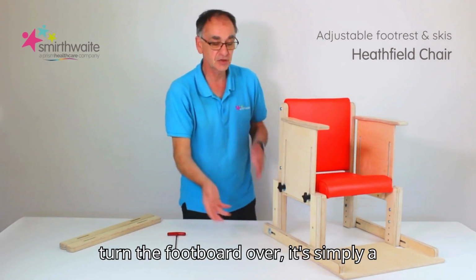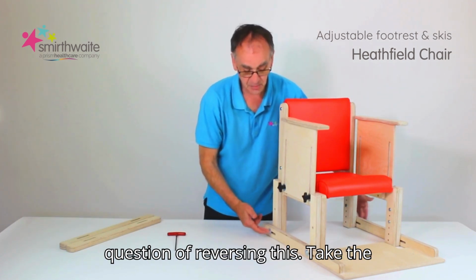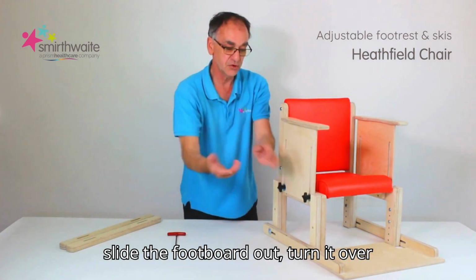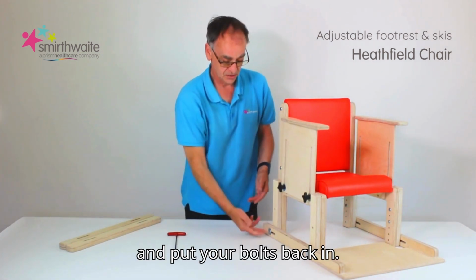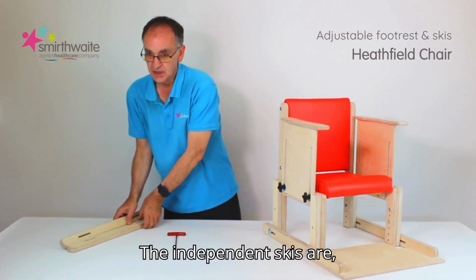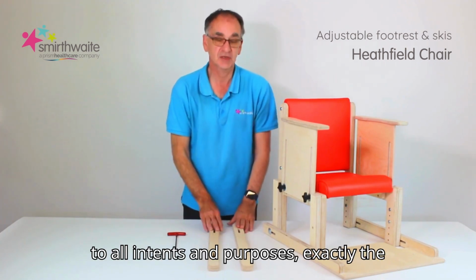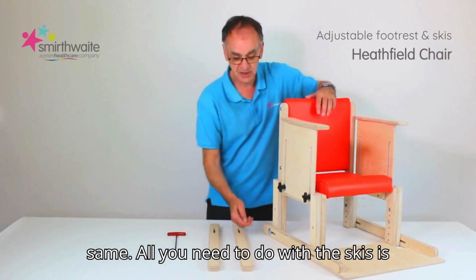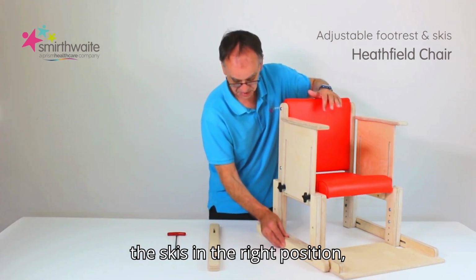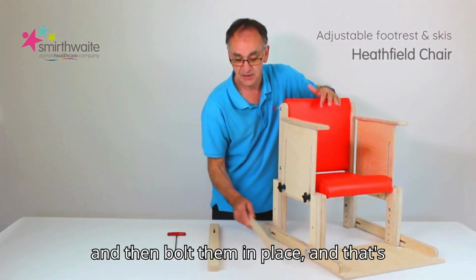If you do need to turn the footboard over, it's simply a question of reversing this. Take the bolts out here and here on both sides, slide the footboard out, turn it over and put your bolts back in. The independent skis are, to all intents and purposes, exactly the same. All you need to do with the skis is you need to take your bolts out, put the skis in the desired position and then bolt them in place. And that's all there is to it.